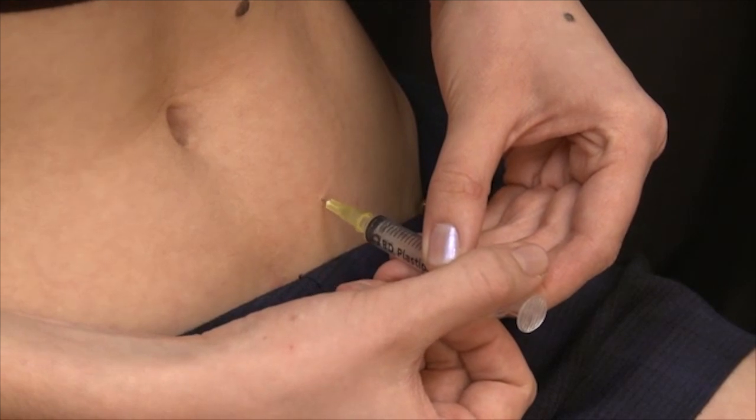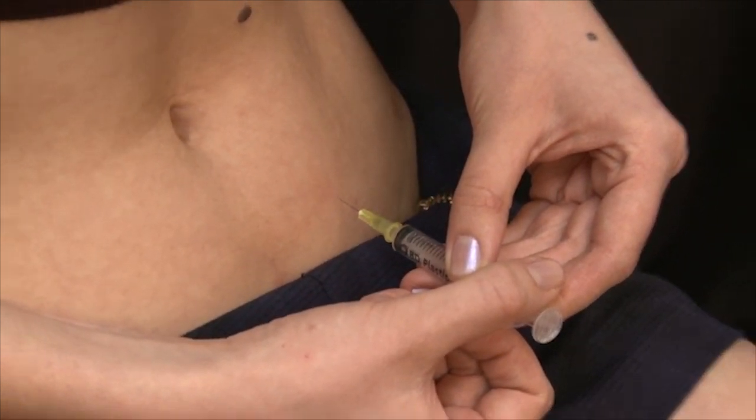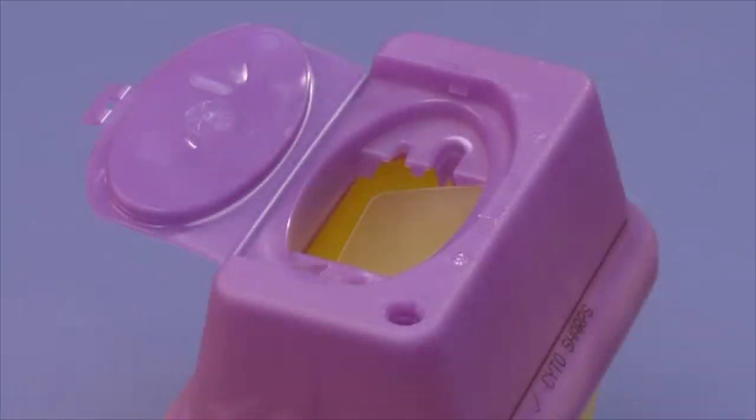Withdraw the needle. You have now successfully given your first injection. Dispose of the used syringe, needle, and any empty vial in the sharps bin. Do not close the lid of the sharps bin until you have completed your whole course of treatment, at which time you should dispose of the sharps bin as you have been advised by your clinic. Please ensure that you store the sharps bin safely out of the reach of children.